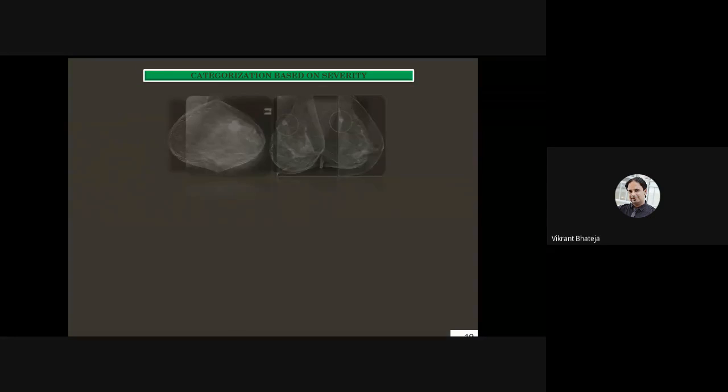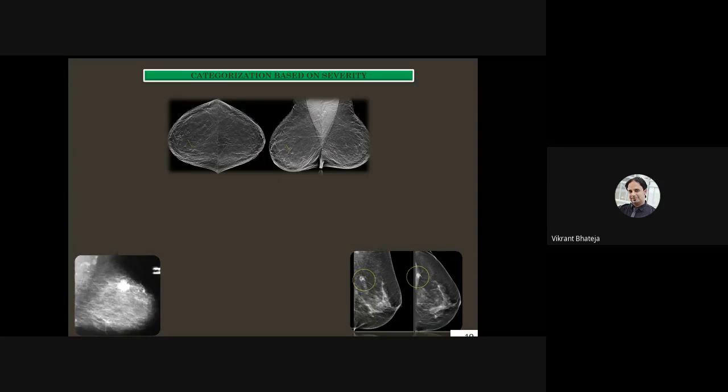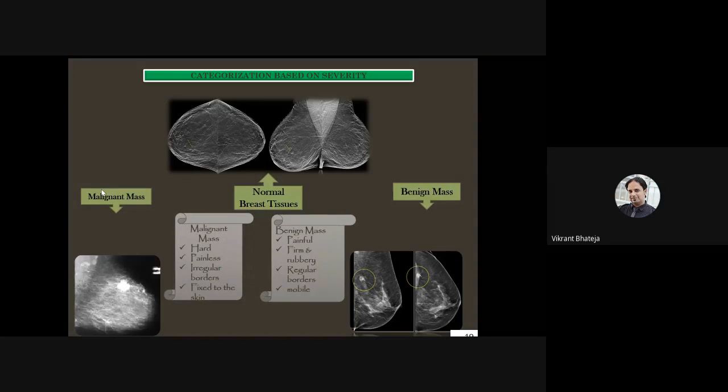Here is an example to show you certain types of these images and how they are classified on the basis of their severity. The top images are the normal mammograms, where there is no anomaly present. In these particular sets of images, one tumor region and another tumor region are marked.